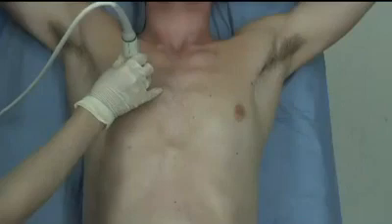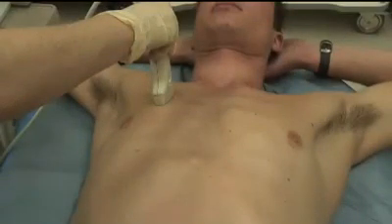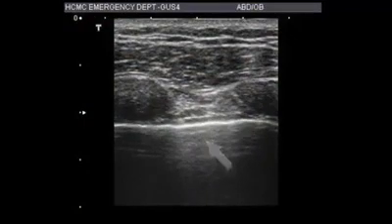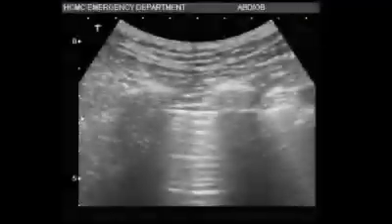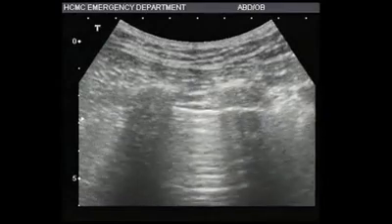Pneumothoraces may also be identified by the absence of the sliding lung sign. Evaluation of the right and left pleural spaces for pneumothoraces begins at the third and fourth intercostal spaces in the mid-clavicular line. The unaffected side should be evaluated first. The probe should be placed longitudinally to include two adjacent ribs. A normal pleural space will show the hyperechoic layers of the pleura sliding beneath the ribs. When a pneumothorax is present, air does not allow for the transmission of ultrasound waves and the sliding sign is not observed.